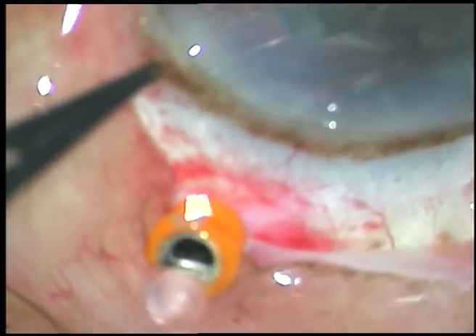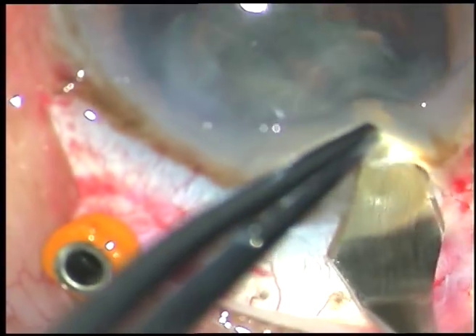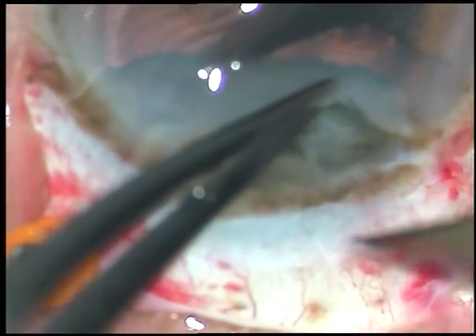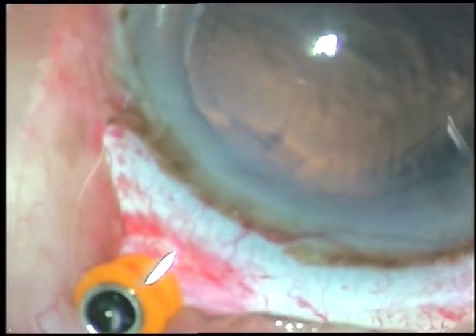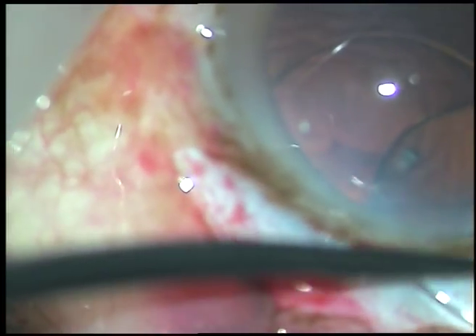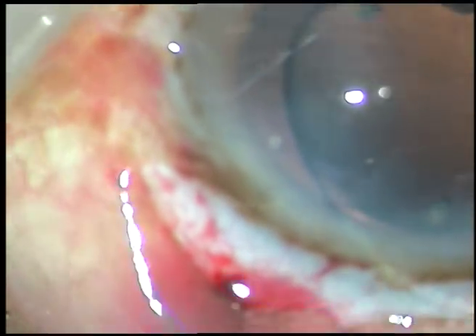The patient belonged to a non-paying category. This is a patient who was screened from an eye camp, and I can't afford to give a multipiece intraocular lens in this case, and so this is a PMMA lens, and this is a very good lens, 6mm optic.